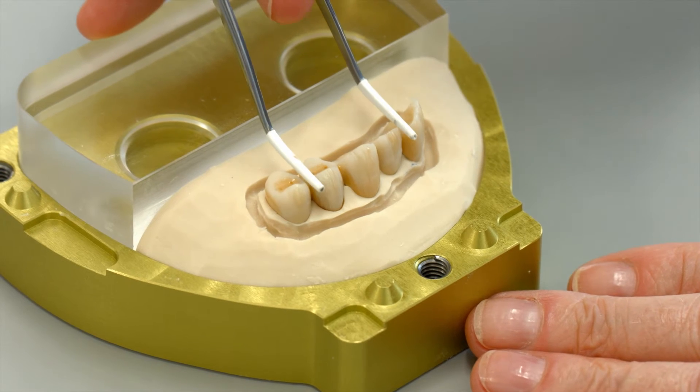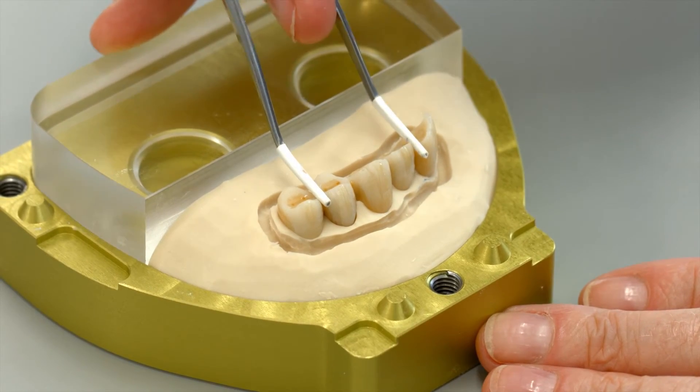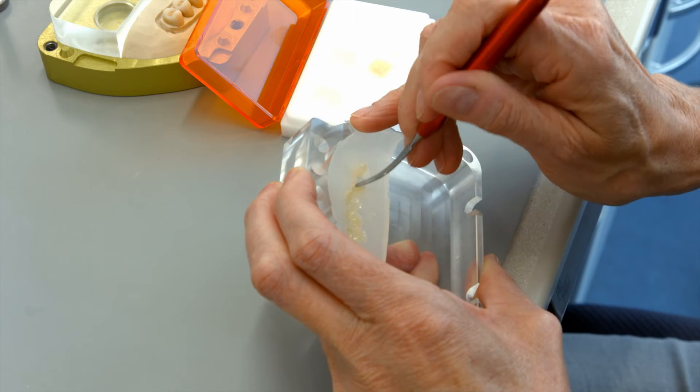Place the restoration on the flask base again in preparation for pressing the incisal material on the dentin layer. Load the opposing mold with a corresponding incisal material and proceed according to the same steps used in dentin pressing.